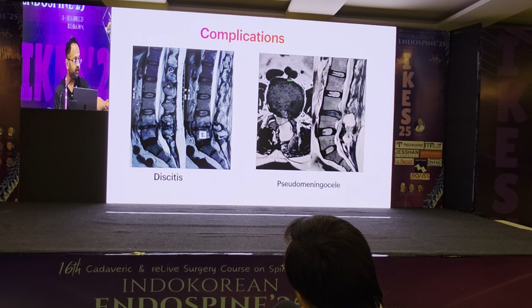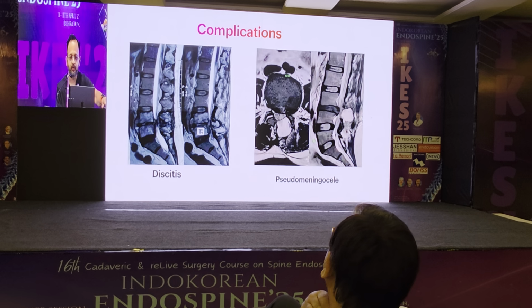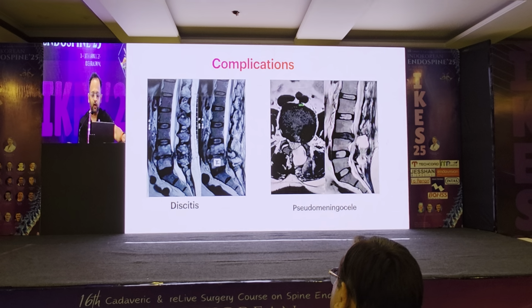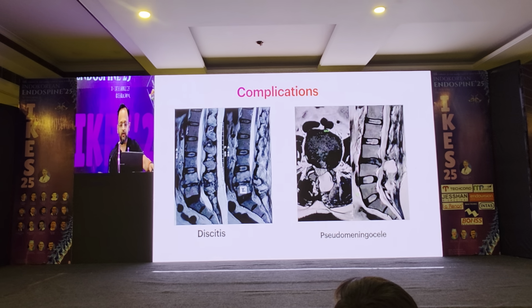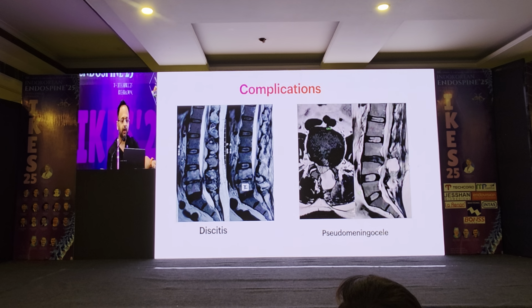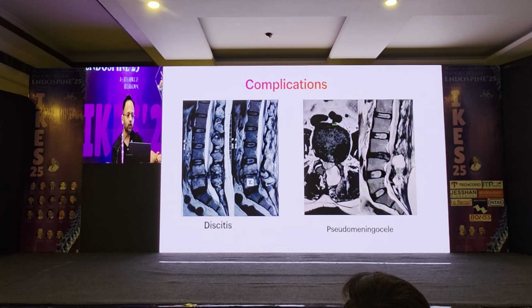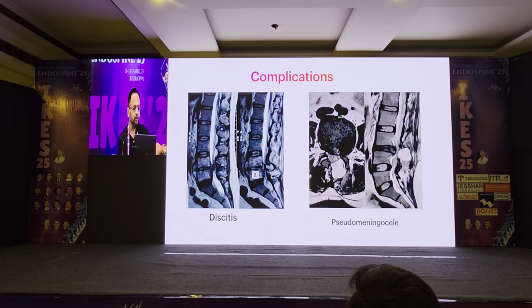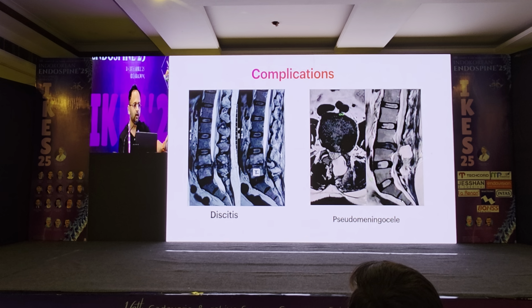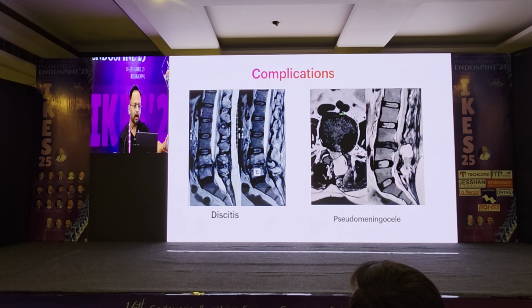The other worst complication is one dural tear which has happened. The problem is I didn't expect the dural tear, which was not visible to me. The patient came back for follow-up, and you can see the decompression is so adequate, the patient is fantastically doing fine, but he has come complaining of a small headache and a small knob in the back. So we did an MRI, there is a pseudomeningocele. So again the technique is the same. You just dive in, start from the good neural structure area. Then the other neural structure is just fibrosis. Just remove the fibrotic tissue and put a glue.